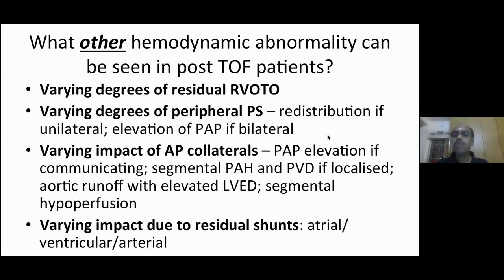Will pressure in RPA and MPA be the same if LPA stenosis is there? Yes, it will be the same. If suppose there is an additional right pulmonary artery stenosis, then the right pulmonary artery may have a gradient. Otherwise, the central main pulmonary artery pressure will be transmitted till the place where you are assessing, as in hilar pulmonary arteries. How will the pullback gradient look across a peripheral pulmonary artery stenosis?